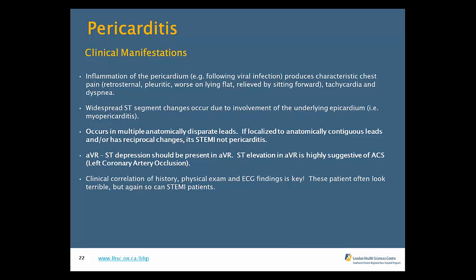But again, from a protocol standpoint, left bundle branch blocks exclude patients from STEMI bypass. And again, ventricular rhythms are going to give you that same left bundle branch block. So if the computer algorithm reads it as a left bundle branch block, they would subsequently be excluded as well.